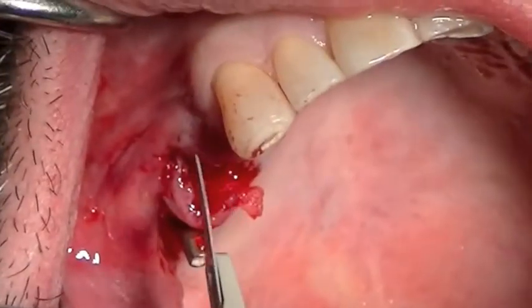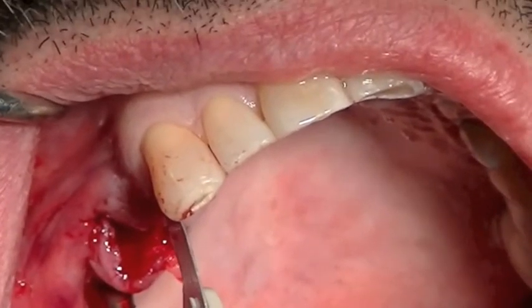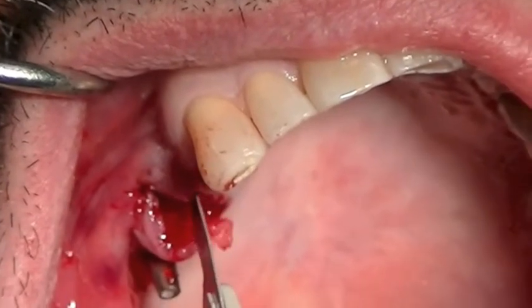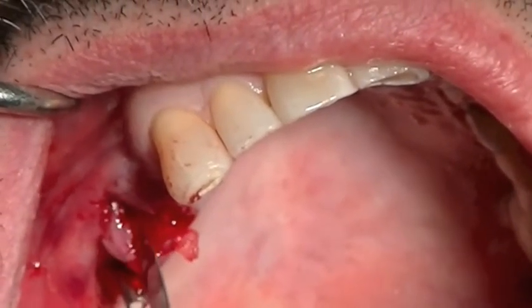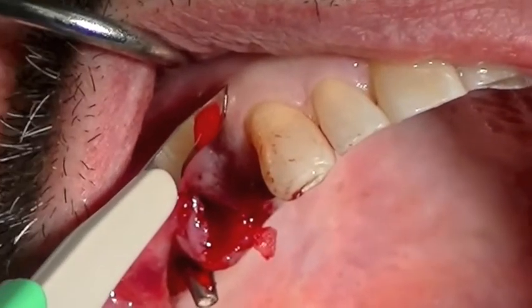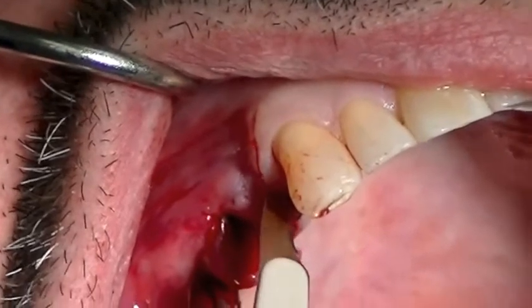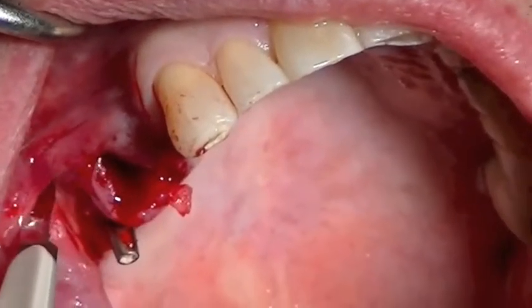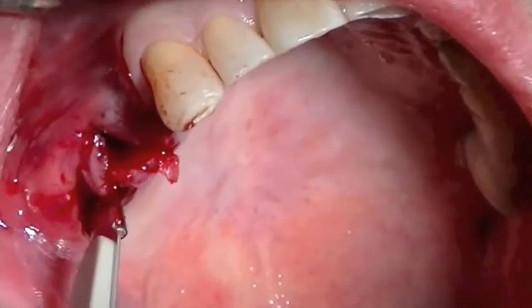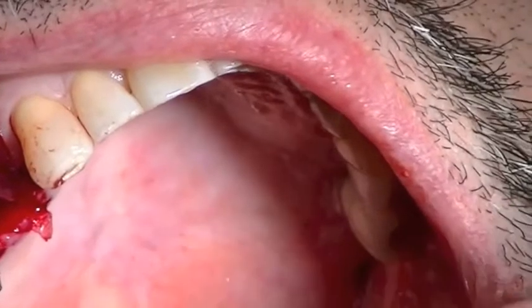Now you can see the significant facial defect in this area. Since we've already anesthetized the patient and removed the tooth, I'm going to use a scalpel to create a flap. My incision is maintained into the attached gingiva — I'm not going into the mucosa, and I try not to go into the mucosa if possible, as that just creates a lot of prostaglandin release and subsequent discomfort for the patient.